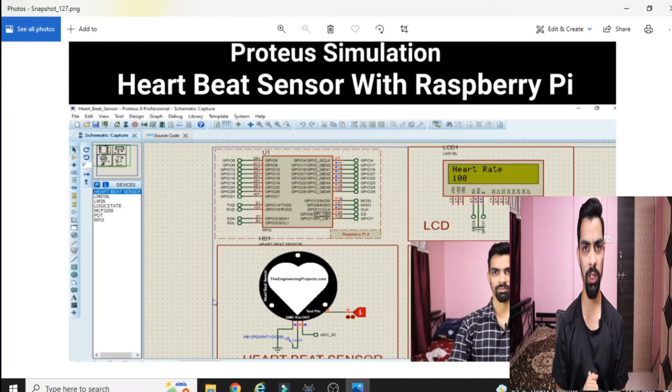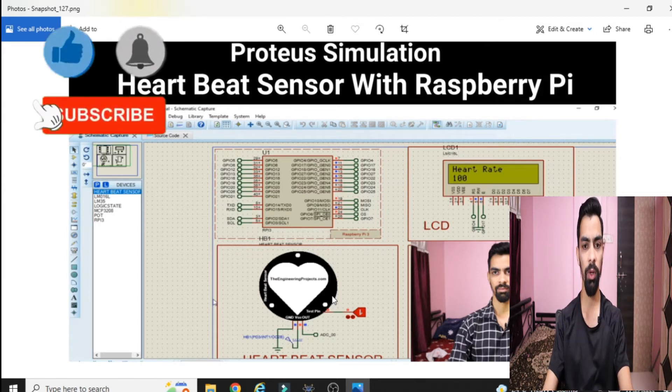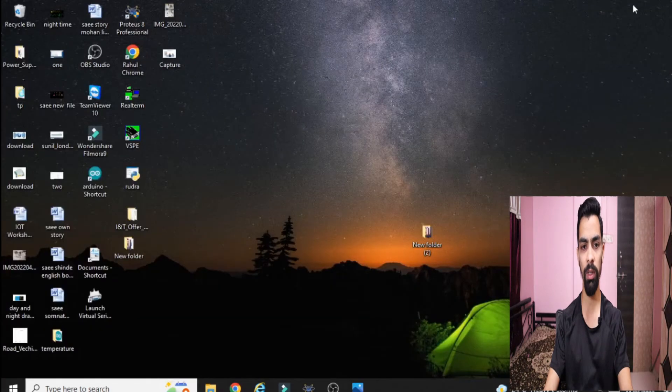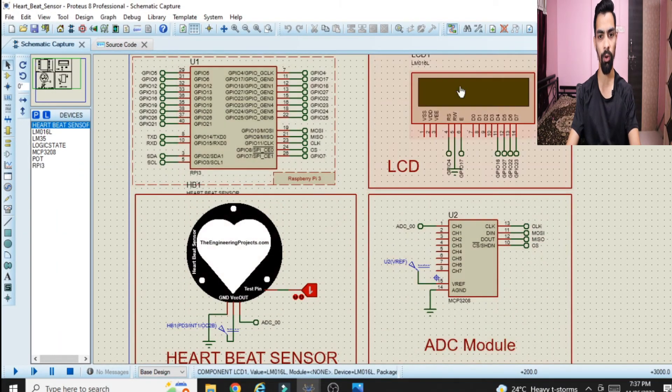Before starting the hardware connection, I should mention I already explained the first part of this project in a previous video — interfacing the heartbeat sensor with Raspberry Pi, including the LCD module. You should watch that first part before this. In this current part we will only see how to interface the LM35 temperature sensor with Raspberry Pi and then combine the LM35 code to print both heartbeat and temperature on the LCD screen.